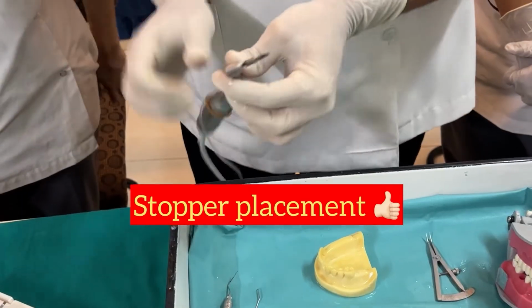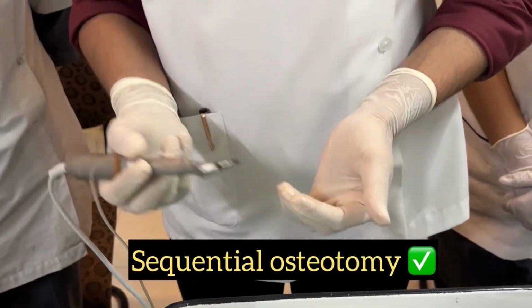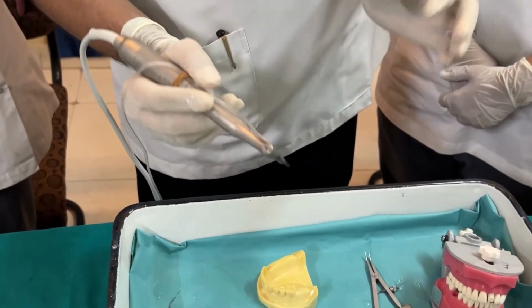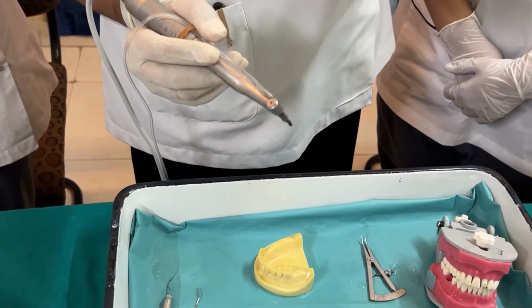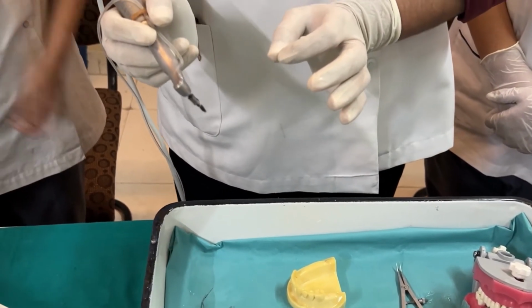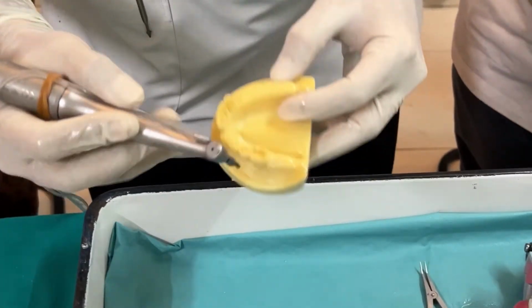So what is this thing called? This is known as sequential osteotomy preparation, and this is the primary fundamental of atraumatic osteotomy preparation. The rule is you are doing bone surgery, but with as little trauma to the bone as possible. Okay. So next drill is what?